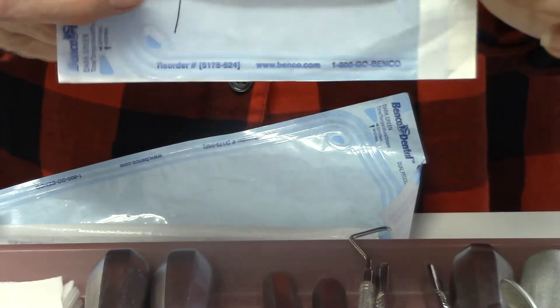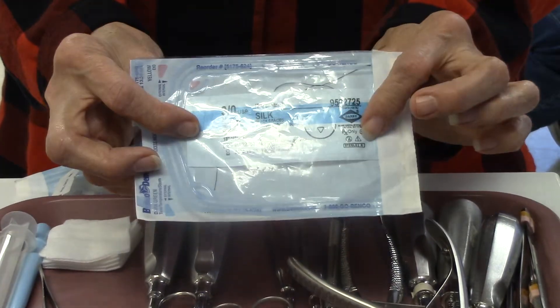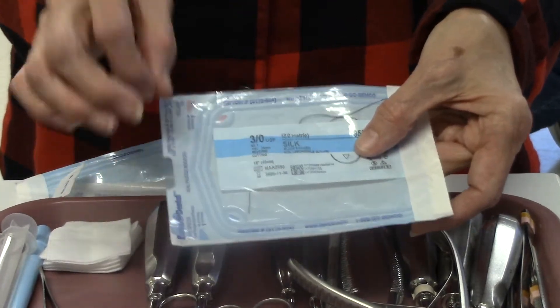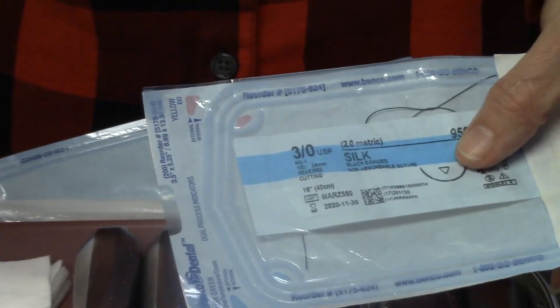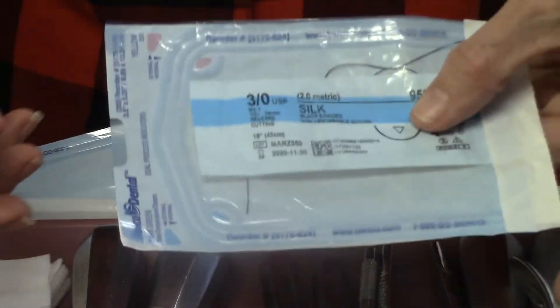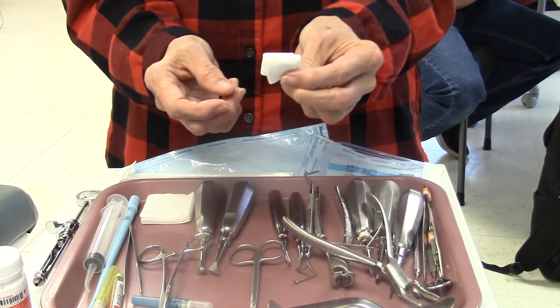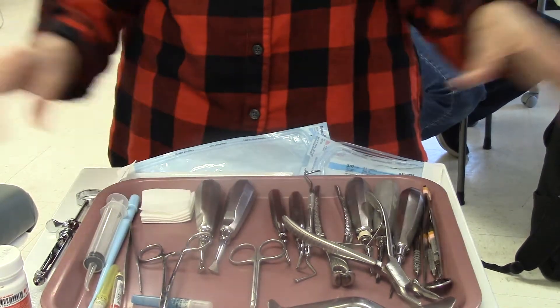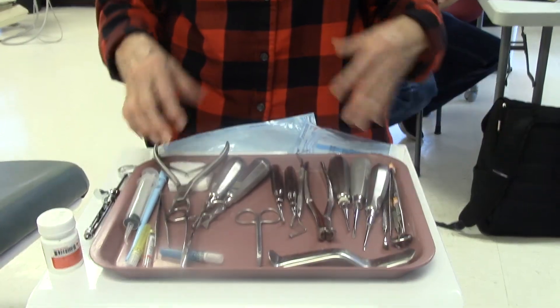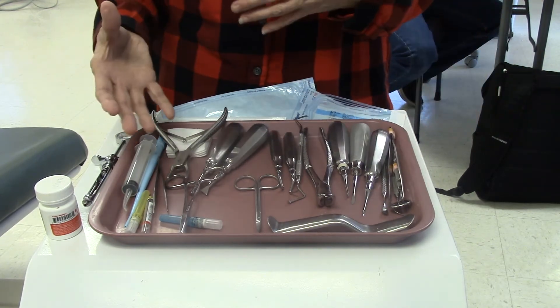And then we have our sutures. These happen to be non-resorbable, but we do have resorbable ones too, which usually come in a gold package. On the end of the suture is the needle, which you hold with the hemostat to pass through the tissue in order to suture it up. We also have our two-by-two gauze, which we fold into a little square for the patient to bite on. So this is a good selection of surgical instruments for a surgical tray — surgical, not basic extraction.